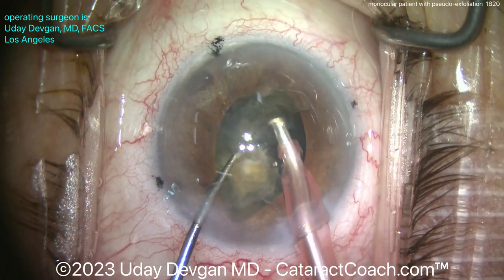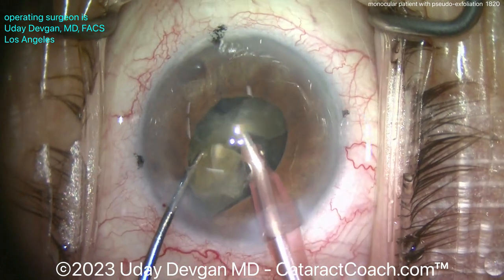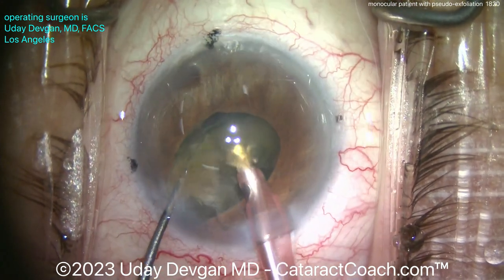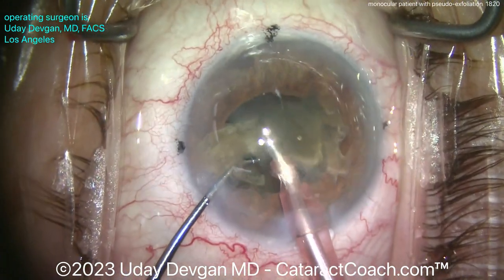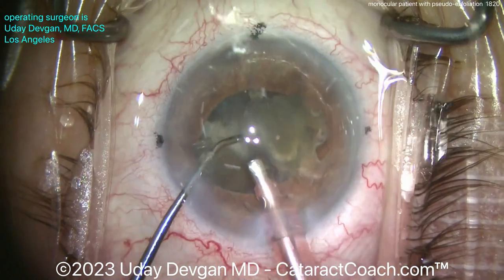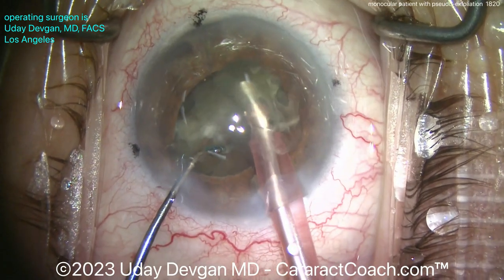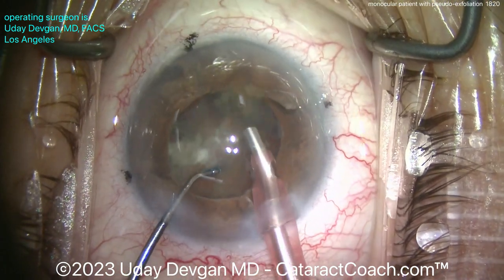I know what you're thinking — you're saying the corneal endothelium is too close. But actually we have a nice deep anterior chamber, sufficient infusion pressure, and we're keeping the phaco probe right at the iris plane. In a case like this with pseudoexfoliation and very weak zonular support, I do not want to operate too much in the capsular bag. Divide and conquer in the capsular bag puts unnecessary stress on the zonular support. The first half of the nucleus is almost gone.